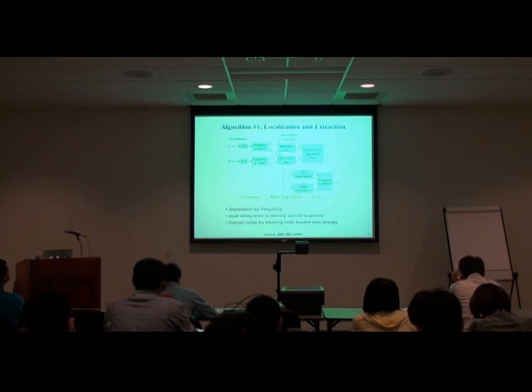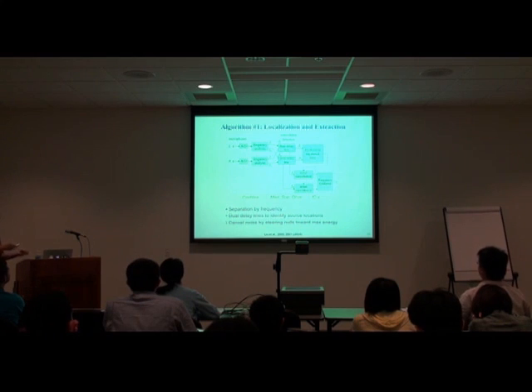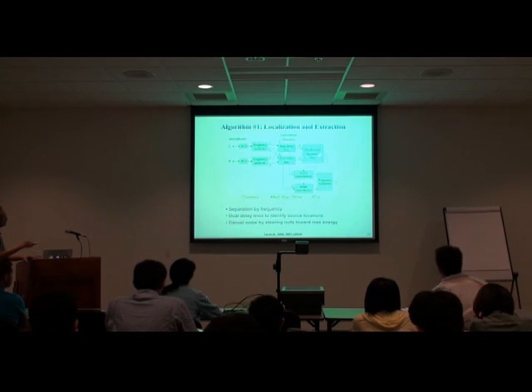From there, we feed the signal into a dual delay line. This is a structure in the brain that we know of that accepts the input from 2 ears. And we perform this very simple arithmetic to see whether that turns out to be the right solution for localization. And we talk about the stencil filter.